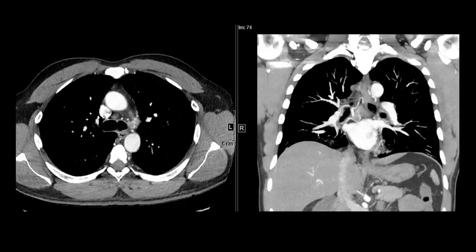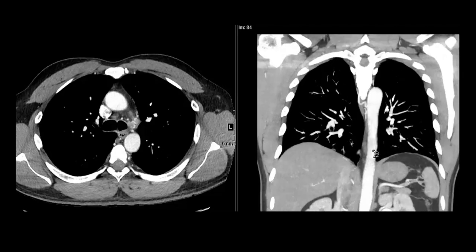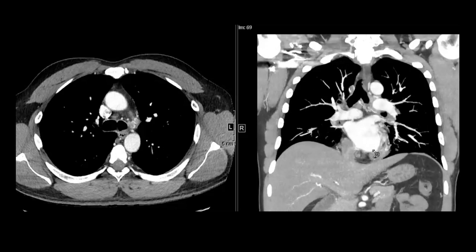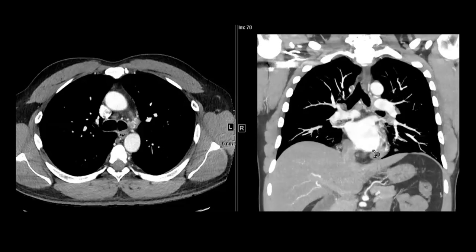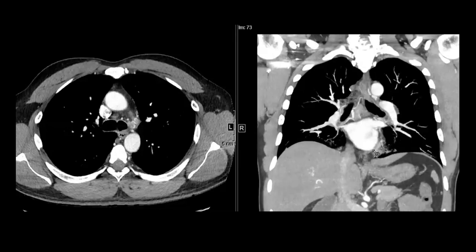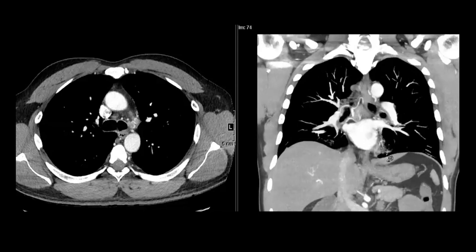I'll go through the MIP images as well, because they show these tortuous vessels better. MIP stands for maximum intensity projection — we discussed this last time but I'll repeat it. In simple terms, what MIP does is stack a few slices together so you see more information overlapped. The problem with vessels is they are very thin, so you may miss them in one section. MIP combines a few sections together so that normal anatomy or even pathology stands out well. You can see there are these tortuous vessels which should not be in the mediastinum.